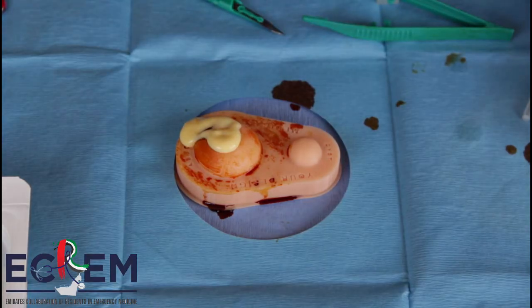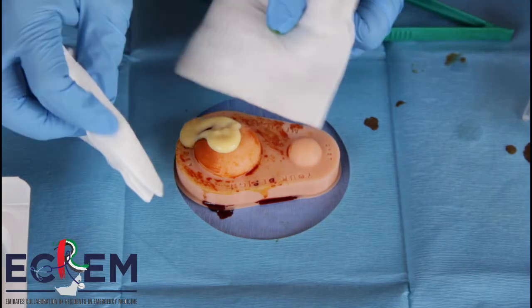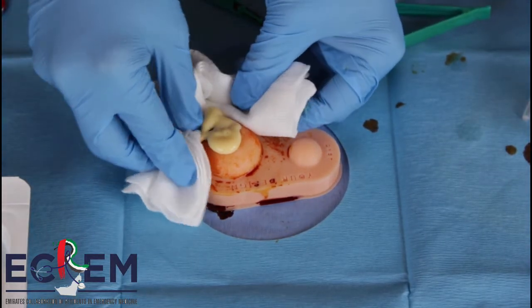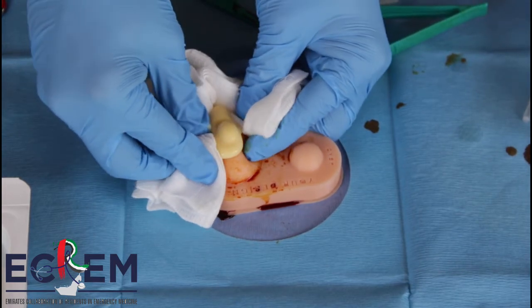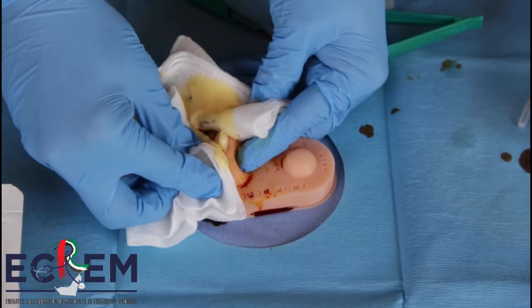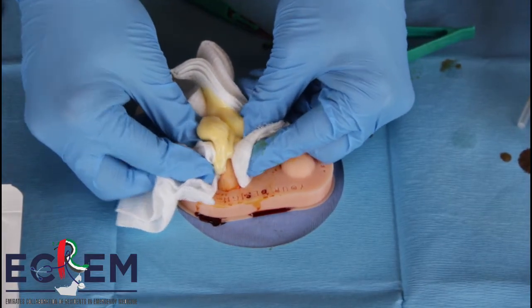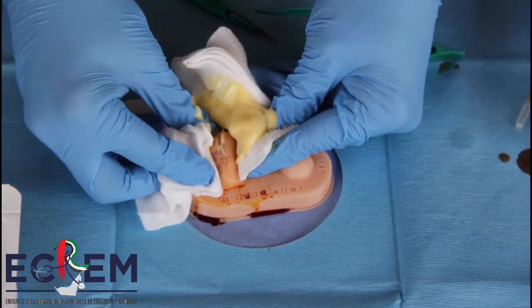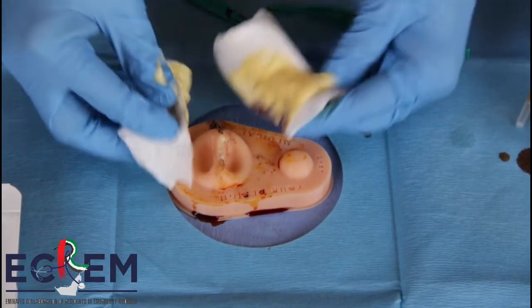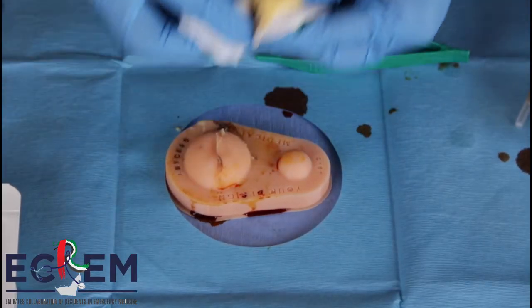Next, you make sure you are cleaning the wound and you squeeze the pus around. You keep squeezing and wiping. You keep squeezing.